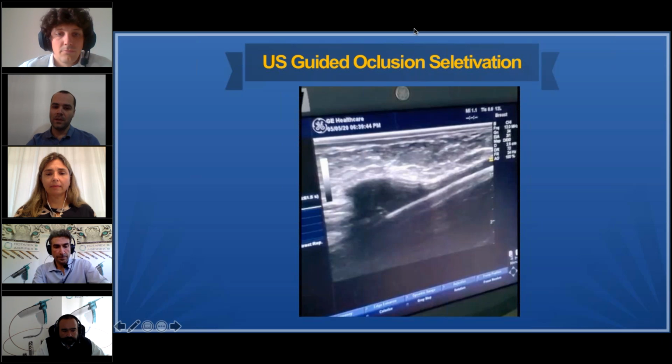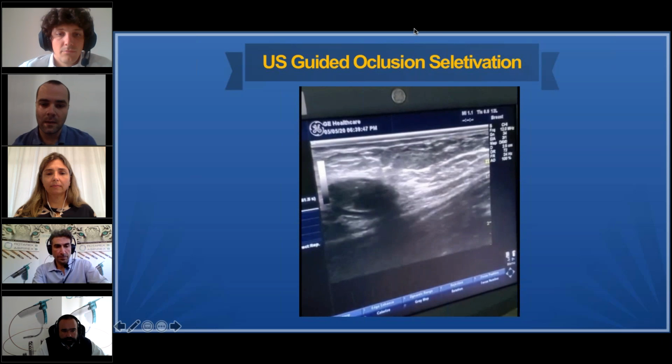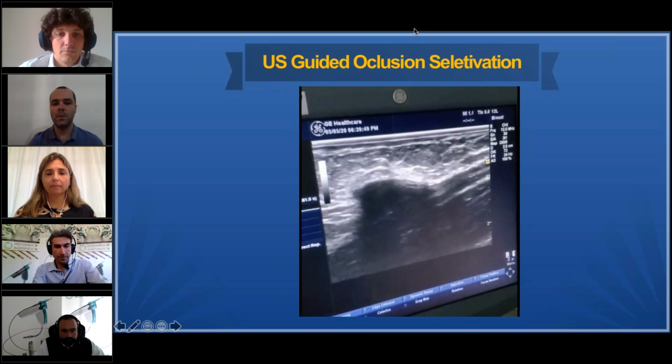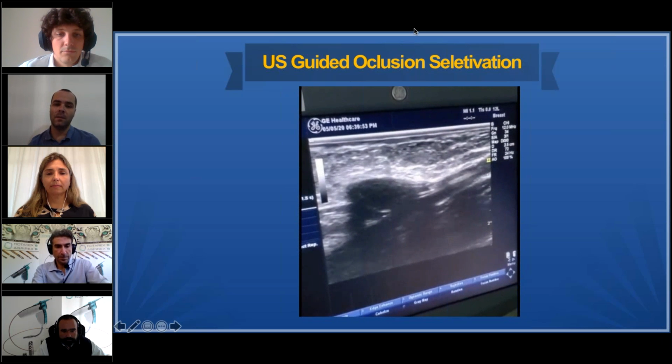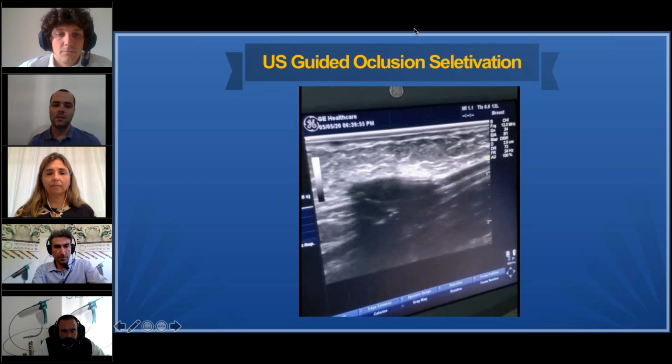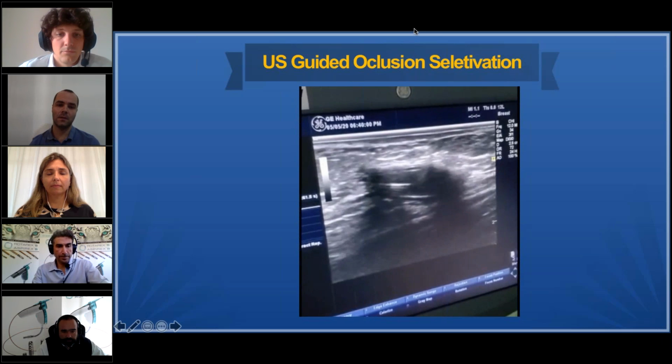With this image, you can see the catheter, the guide wire, and the brachial artery by the ultrasound. At the same moment I put the catheter in the anastomosis, I push the guide wire, spin the catheter in the occlusion, and push the guide wire again, so the guide wire, as you can see, is inside the graft.